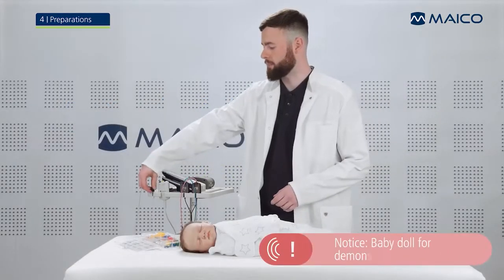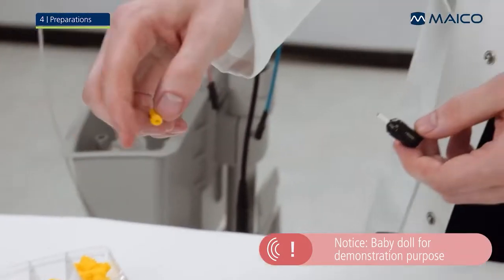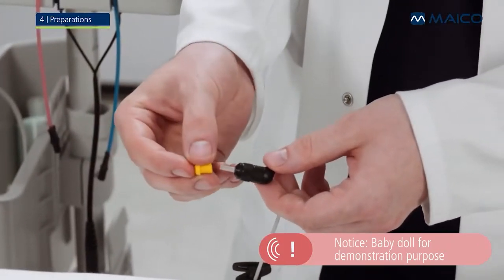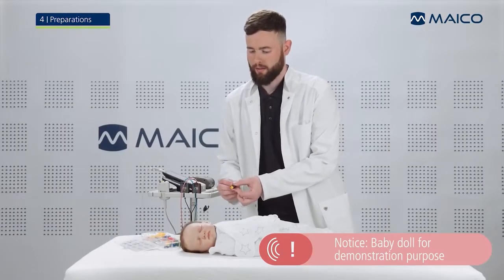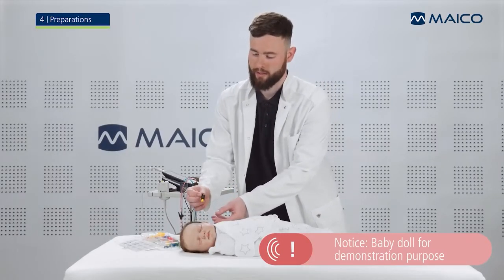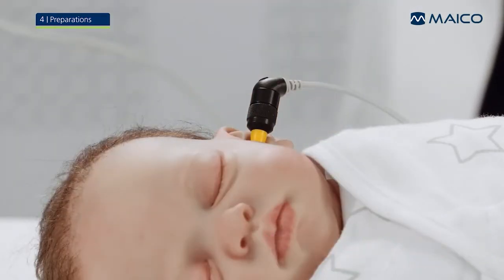Select an ear tip that matches the size of the baby's ear canal. Connect the ear tip to the probe tip so the probe tip is completely covered. Now place the probe gently and securely into the baby's ear canal. Make sure that it does not fall out too easily.